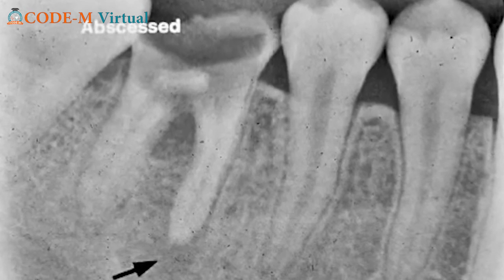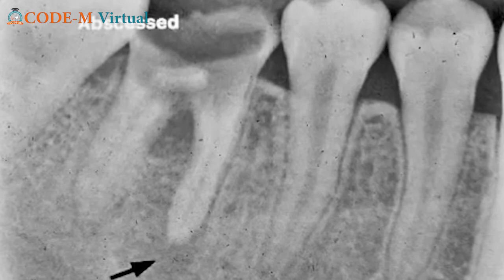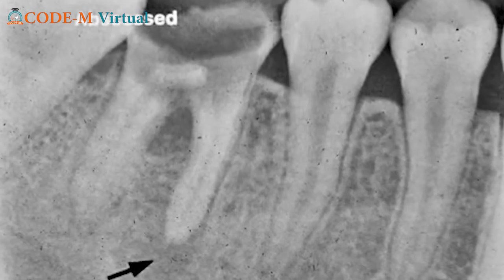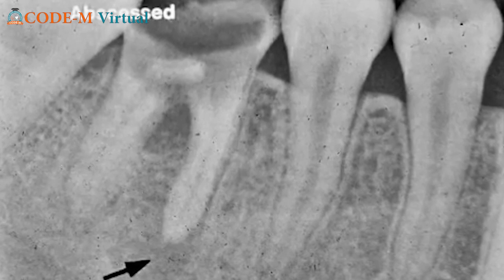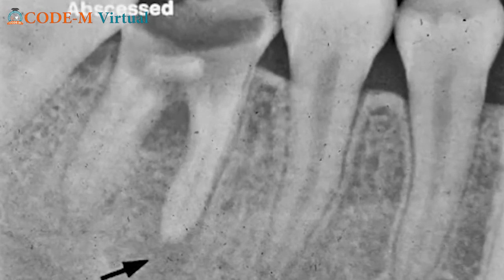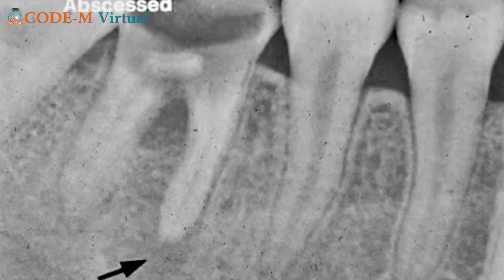The radiolucencies can be of other reasons as well. There may be some granuloma or some other cyst as well. And we can see in the crown portion that the crown of this tooth is almost completely obliterated.